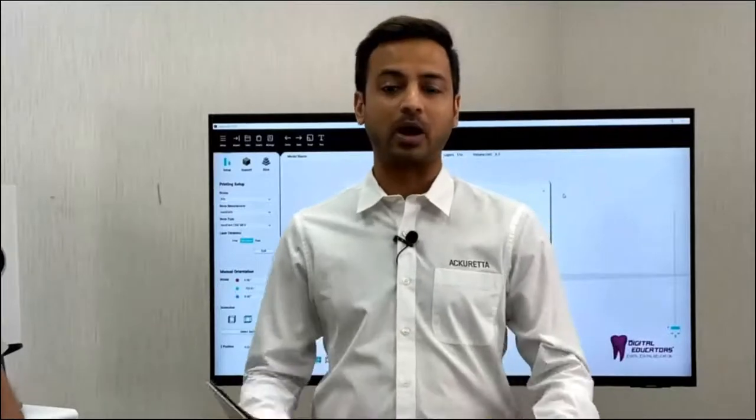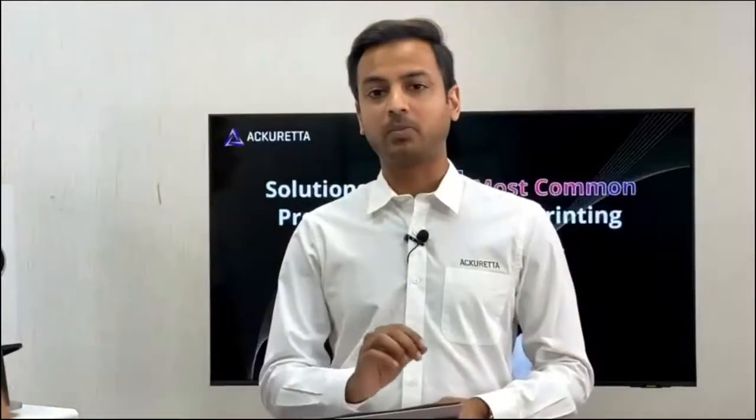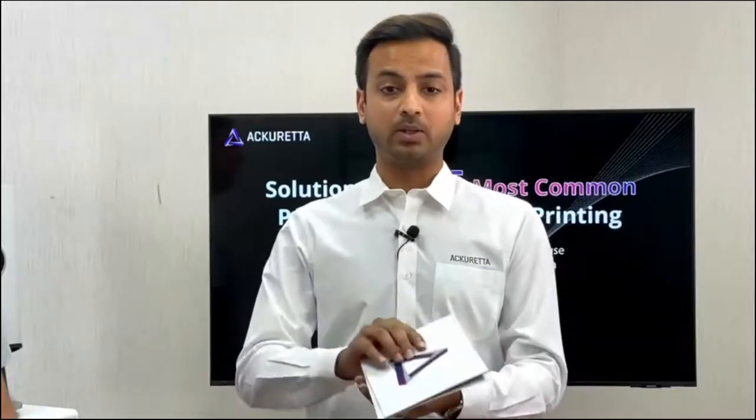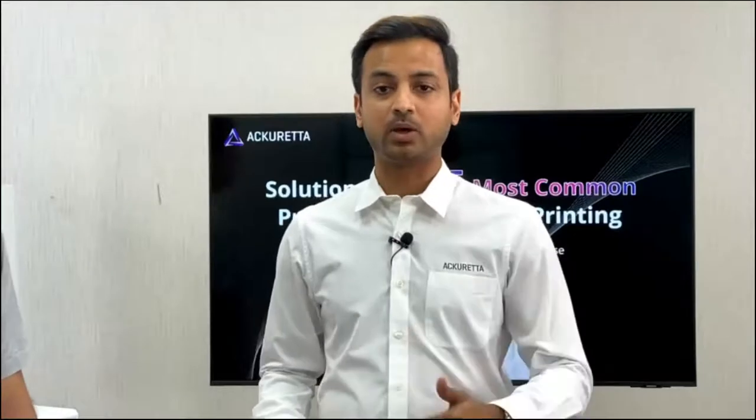So typically, in terms of our validated workflow process, we only certify a material if it can show us an 80% accuracy within a plus minus 100 micron range. Therefore, what we do is we print the part, which is post-cured, and after printing it, we compare it with the STL file and do a mesh overlap. And in that process, if we see an 80% or above match within the 100 micron range, then we consider it to be of a clinical standard. And we've been performing such experiments for years, and we can safely say that is enough for those specific applications such as models and surgical guides.